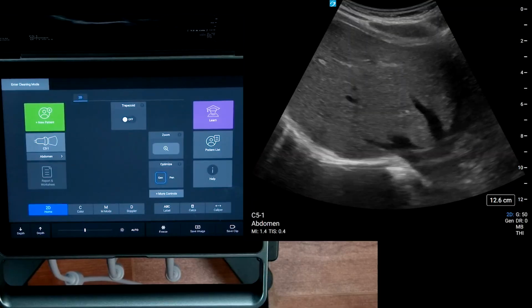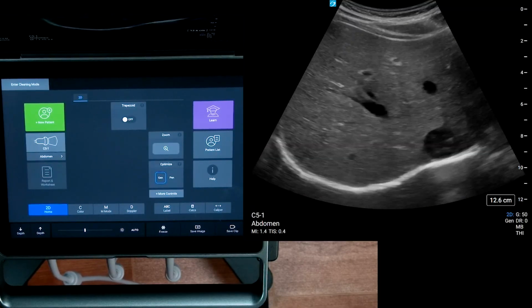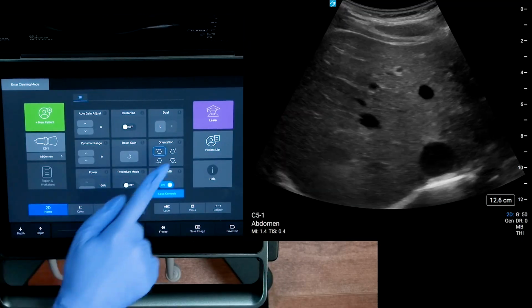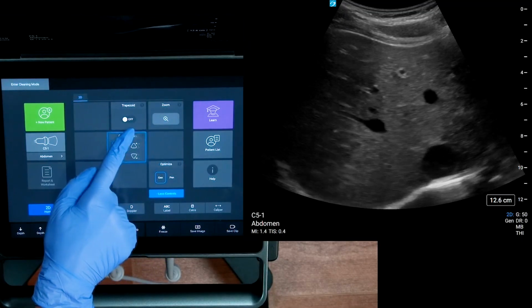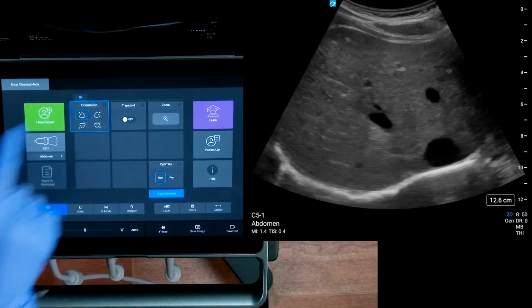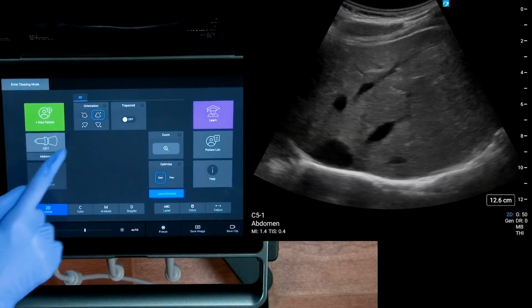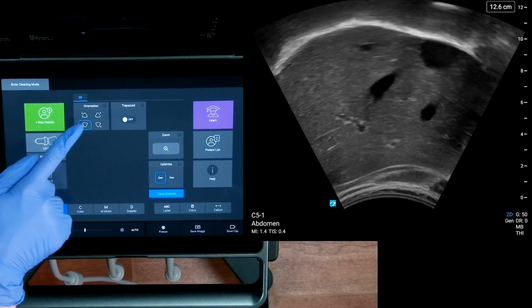Many of the system's image controls are available using the touch panel. You can view more controls and even optimize the placement of the controls to suit your needs. For example, tap the different options on the orientation control to adjust where your orientation marker is on the image.